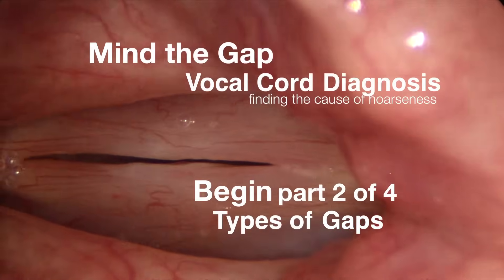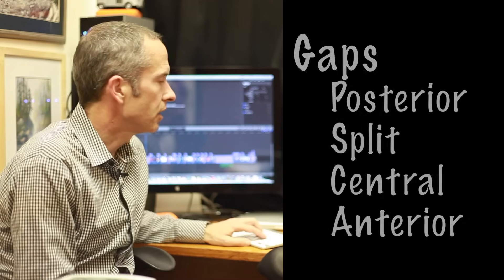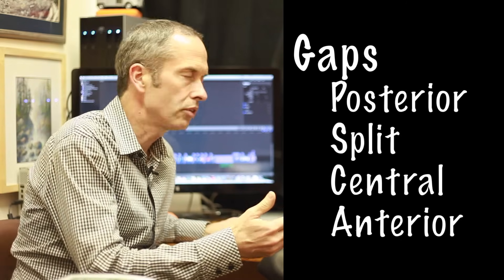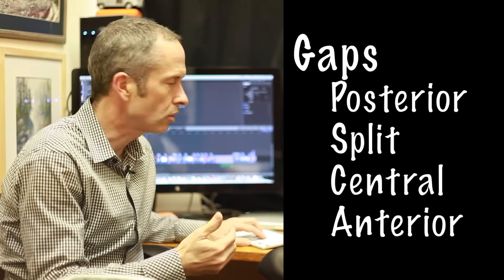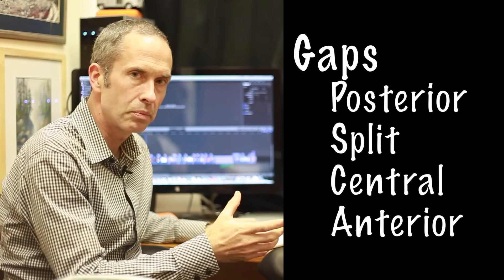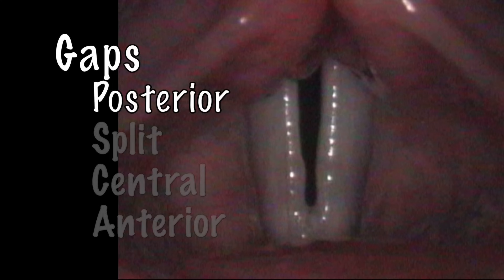Let's dissect into various kinds of gaps that we could have. Gaps can occur at the back of the vocal cords. They can occur between two segments of the vocal cords — I'll call those split gaps. They can occur in the middle, or they can occur in the front or anterior. Let's take a look at some samples.